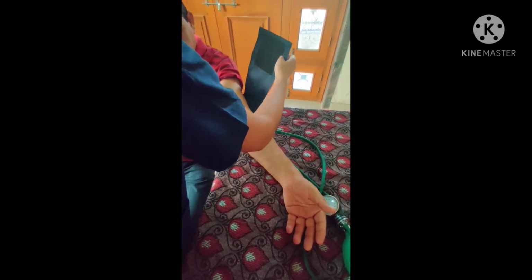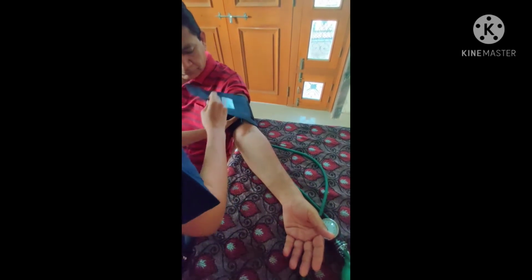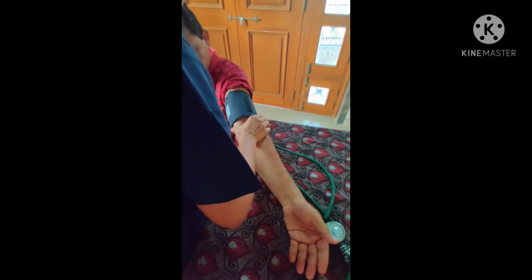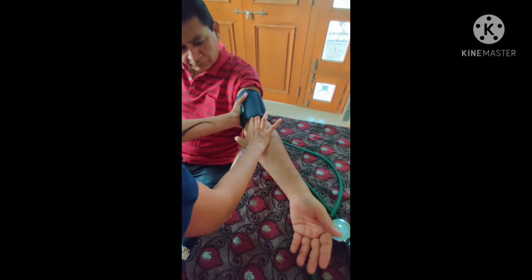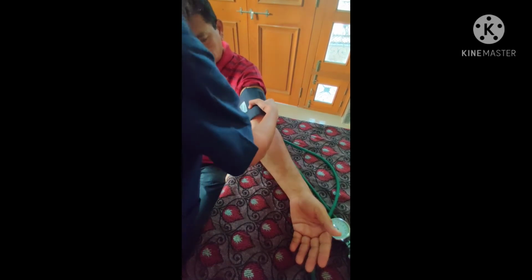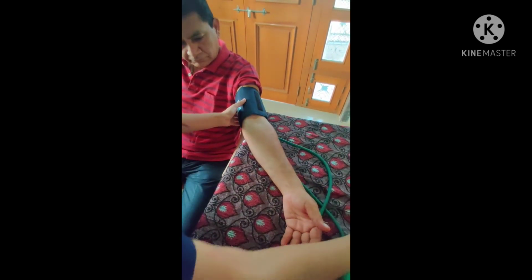Now, with the arm at heart level, center the inflatable bladder over the brachial artery. The lower border of the cuff should be about 2.5 centimeters above the antecubital crease. Secure the cuff snugly. With your index and middle finger, check that the bladder is not too loose or tight.